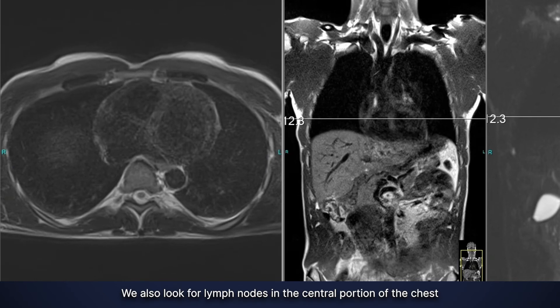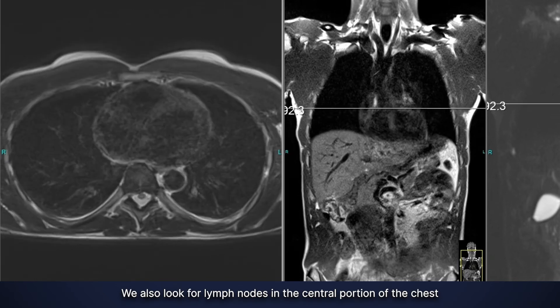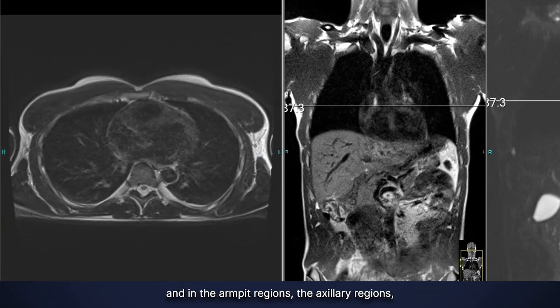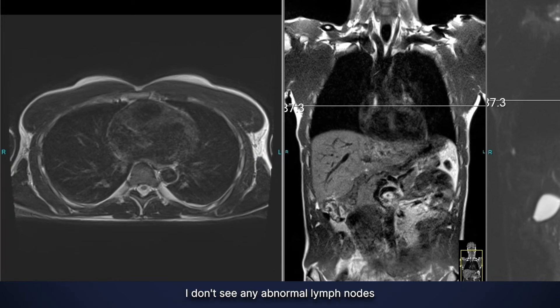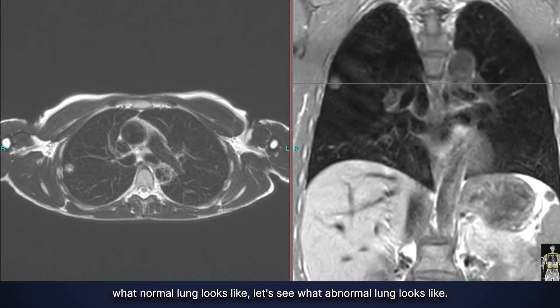We also look for lymph nodes in the central portion of the chest and in the armpit regions — the axillary regions — just like we did in the neck. I don't see any abnormal lymph nodes centrally, nor do I see them in the axillary regions on both sides.